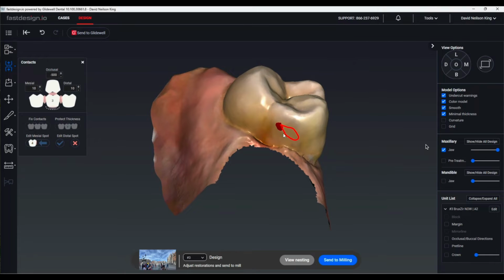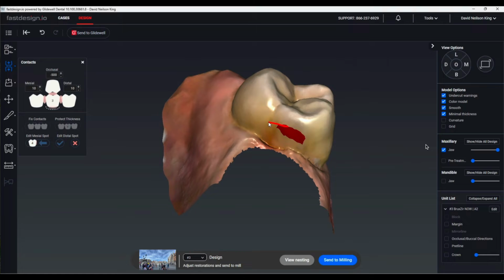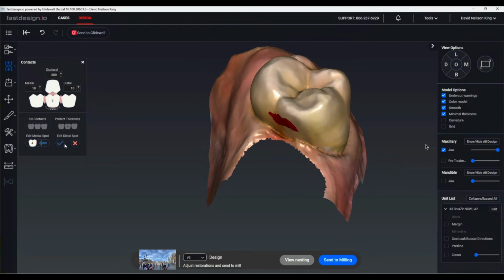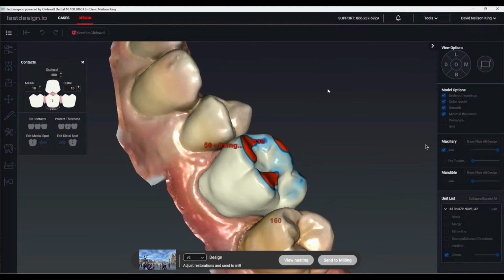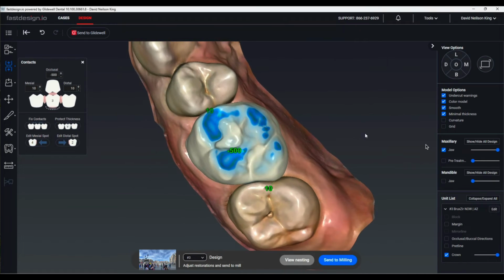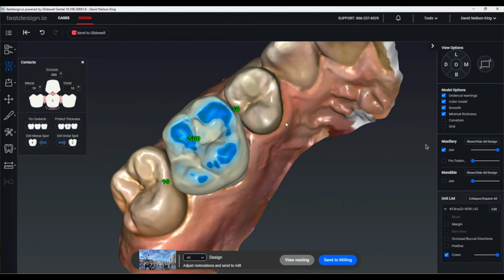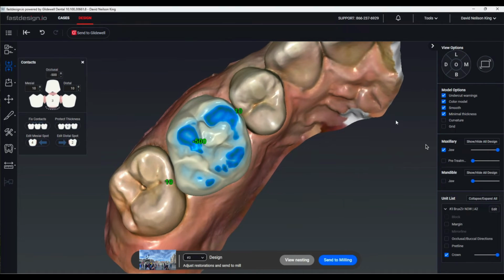Same thing here. Let's make that a little bit wider. There we go. Okay, we're going to hit Fix Contacts, and what it's going to do is fix all those areas as well as the occlusion. So you see it took the occlusion down and it brought that up. So theoretically, if I were to just hit Mill right now, there's a good chance it would fit just fine into the prosthetic she's already wearing, the night guard.